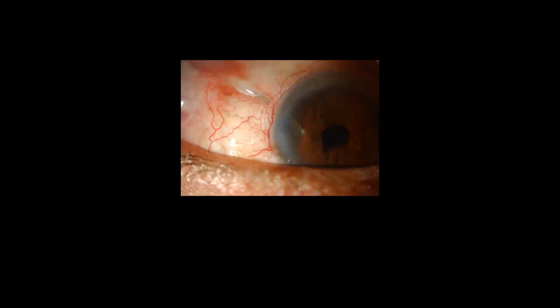After that, we'll look also at the fundus. We have to examine it as well for baseline. And also one thing regarding the plate, we have to look at it. Is it only the tube or also the plate that is exposed?